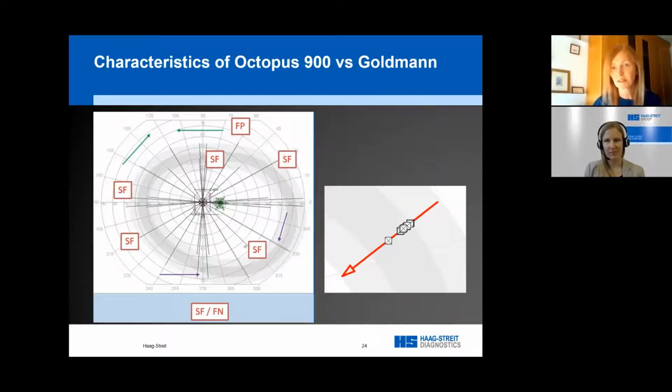So, repeated testing of the random vectors for false negatives gives a very good indication of repeatability within the test. And it highlights variability that you can then target and test further if that's what you want to do. And apart from random checks, if you do have a suspect vector, you can just click on it and it'll repeat again. So there are a lot of things you can do to iron out potential inconsistencies, but still very similar to how you did it with Goldman.